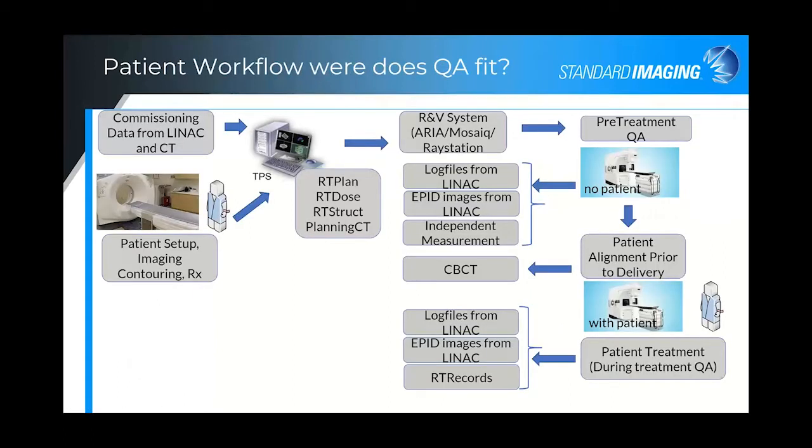As I go through the presentation, because I'm a visual person, but unfortunately without a lot of artistic talents, I put together this workflow chart to keep track of the portions of the workflow touched by the different plan-specific QA solutions that we can combine to review all of the different steps throughout the workflow.